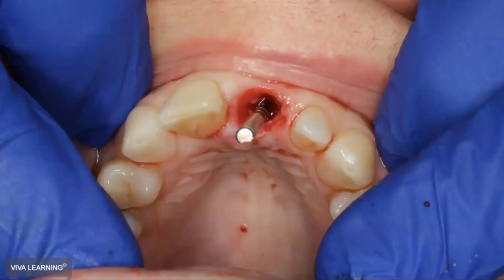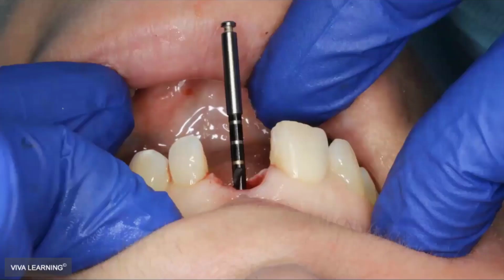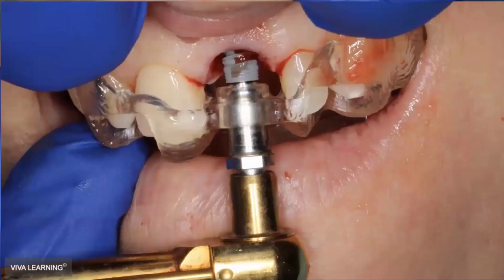So you've done the osteotomy with the 2.0 pilot, and we're judging our angulation. There's a lot of bone in this case, so I didn't necessarily need an X-ray. But I do like to put it in there, kind of look at it from a couple different angles and see what is going on. So after we enlarge the osteotomy with the burrs, we go ahead and place the implant through the guide.